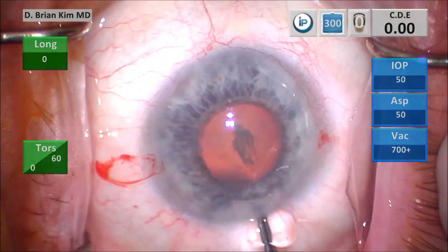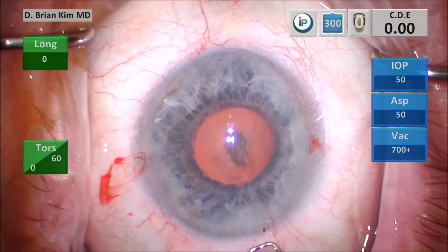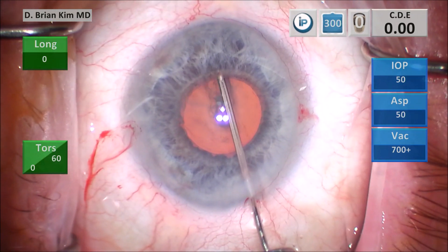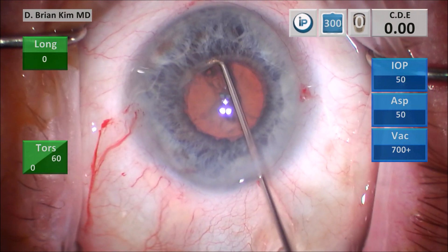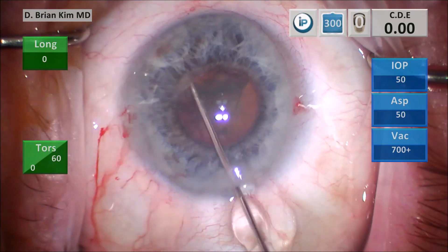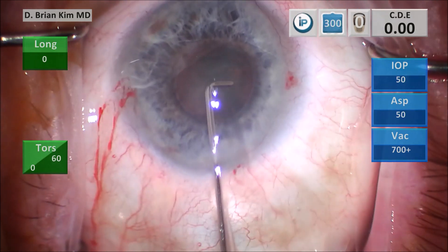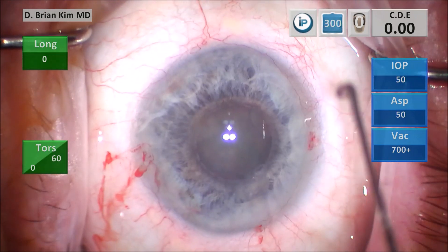I'm going to burp some viscoelastic out. This is the capsular fornix hydrodissection technique. I'm placing the cannula underneath the anterior capsule edge, contra-incisionally, into the capsular fornix, pointing the tip down, getting a nice fluid wave, pointing the tip back horizontally, and decompressing on the left side. I'm able to spin the lens, and then spin the lens on the right side pointing it down. This technique does not require direct visualization, and you get a nice fluid wave every single time.